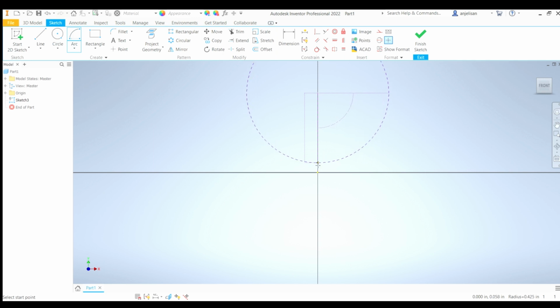And then we go down until we reach the origin. And then it's asking us where we want to sweep this arc. Go ahead and type in 90. You can do that since that text box was highlighted. So now it sweeps only a 90-degree angle.